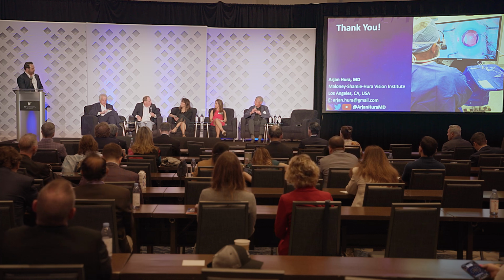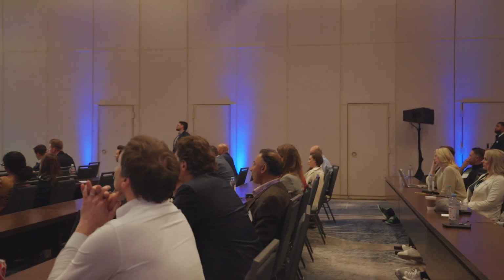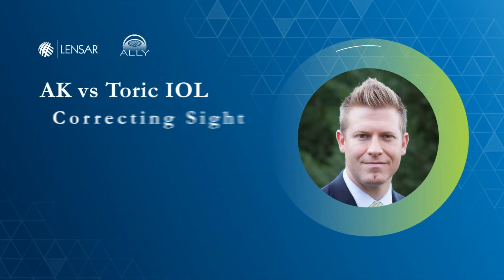Same. I use it all the time. I think it's important to just expect skipped areas or tags, and don't just pull on the cap, but rather go around as though you're going to do a capsulotomy, and break the tags. But I agree with you. I think it does a really great job going through the RKs.